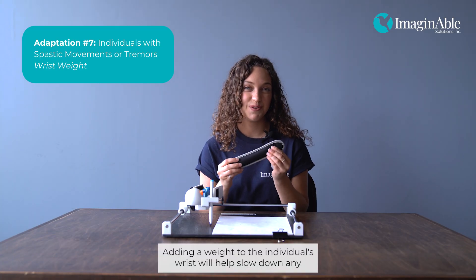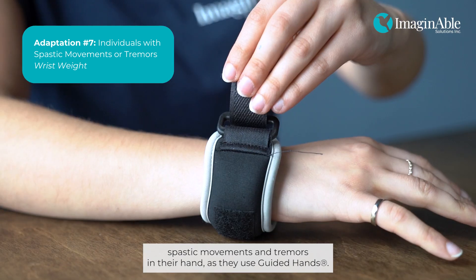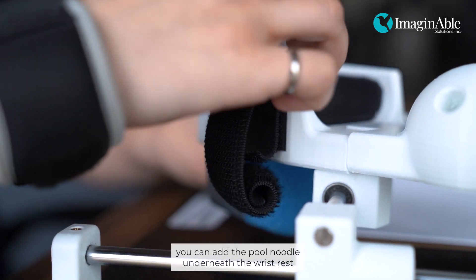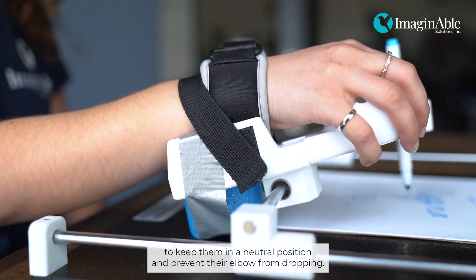Adding a weight to the individual's wrist will help slow down any spastic movements and tremors in their hand as they use Guided Hands. If you see that their elbow is dropping because of the weight, you can add the pool noodle underneath the wrist rest to keep them in a neutral position and prevent their elbow from dropping.